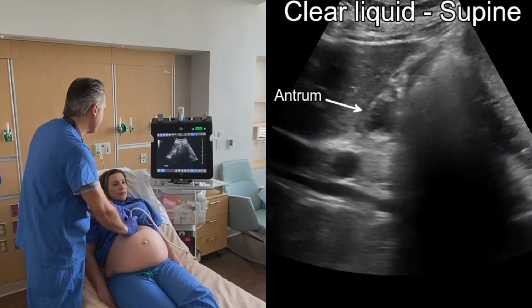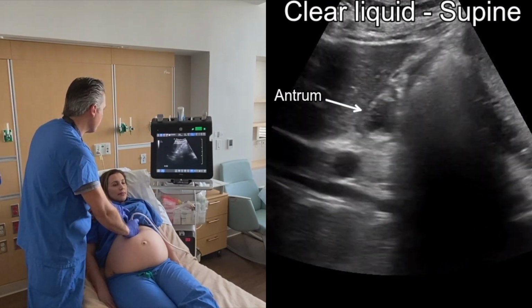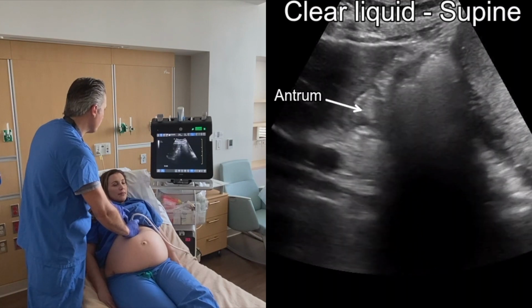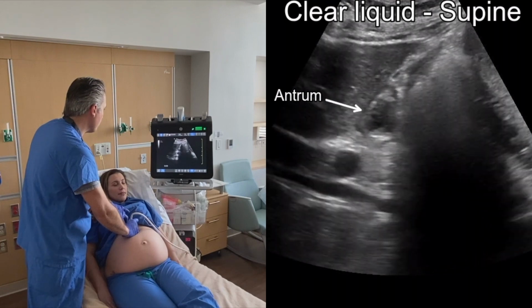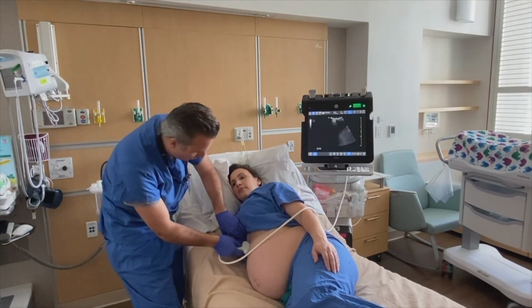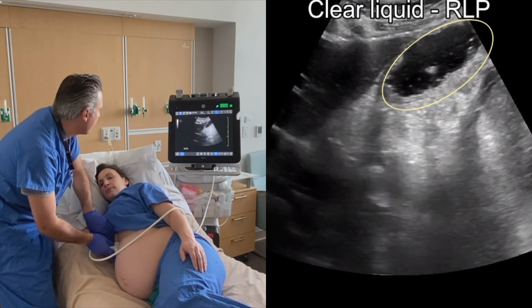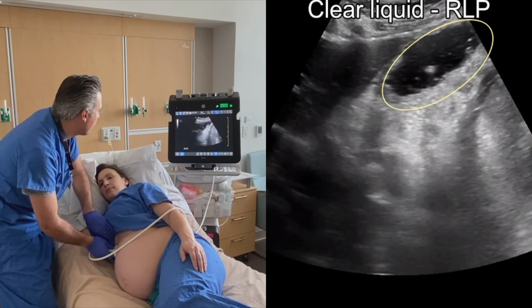We are now visualizing the gastric antrum in the supine semi-recumbent position. Fluid appears dark and air bubbles appear white on the image. Measure the cross-sectional area of the gastric antrum between peristaltic contractions. In the right lateral decubitus position, as the fluid shifts with gravity, the cross-sectional area of the antrum is noted to significantly increase.